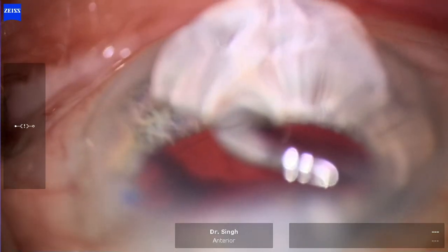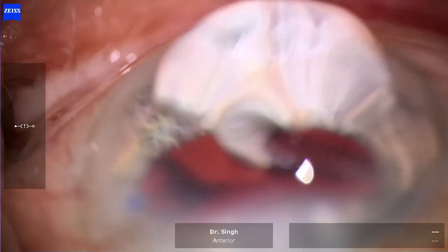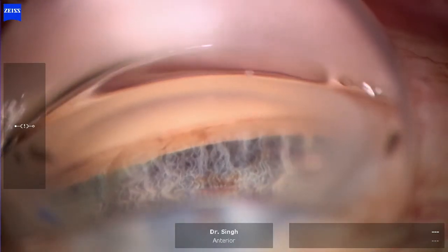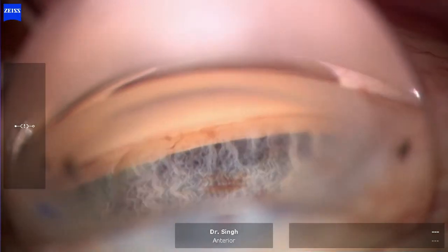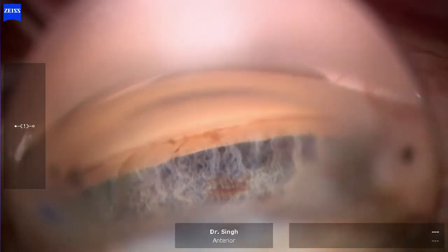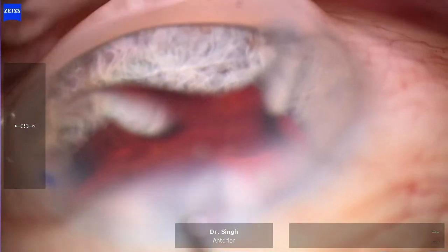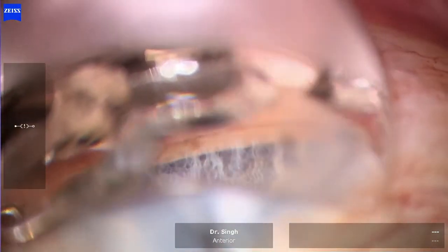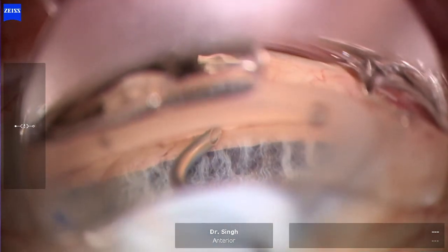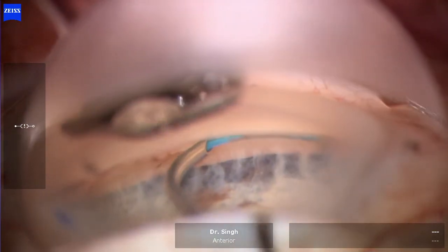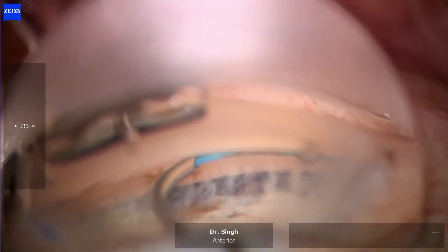I'm putting more viscoelastic on the cornea and in the anterior chamber. Now I'm going to flip my prism and go the other 180 degrees. Entering with my Omni device again — this time I'm not quite as acute as I approach the angle, about a 35 to 40 degree angle, and I'm letting that catheter enter into Schlemm's canal. It slides in beautifully as well. Now I'm going to do the other 180-degree viscodilation and then perform my trabeculotomy.